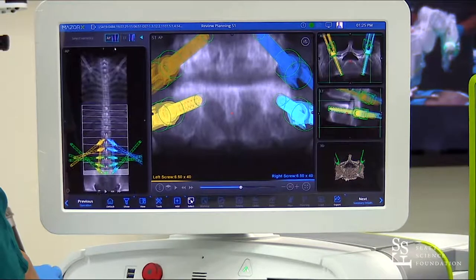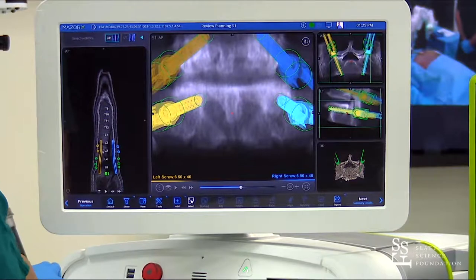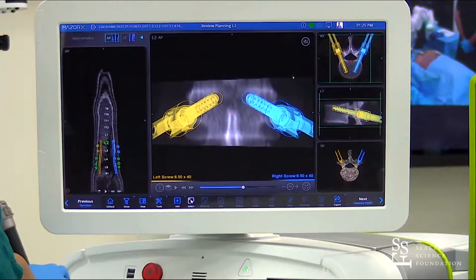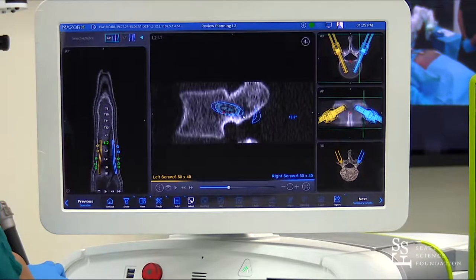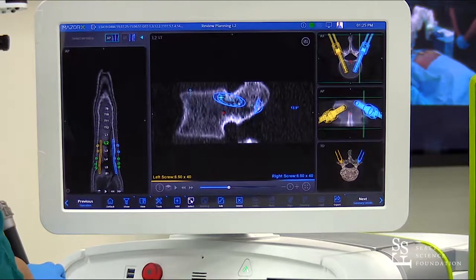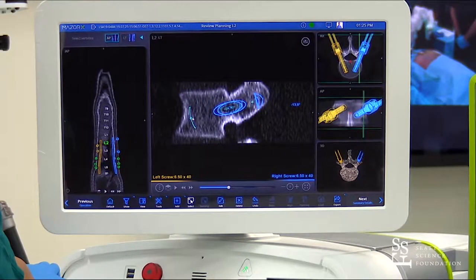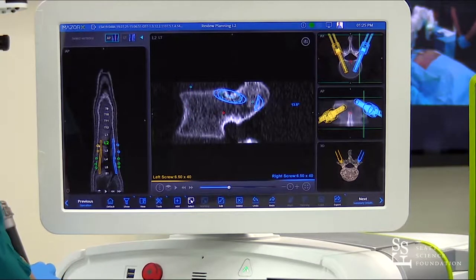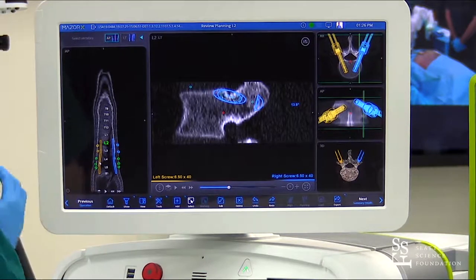Can you go back to that skin incision? At the skin level, if I go to L2 on the sagittal, you see how this trajectory is optimized to start low and go high to bring the skin incision down. If I bring this up, you can see in real time that skin incision is moving. So the dots on the outside, lateral to the rods, are the skin incisions. When you're doing a percutaneous case, the skin incisions can be clustered together to minimize your exposure on the skin.